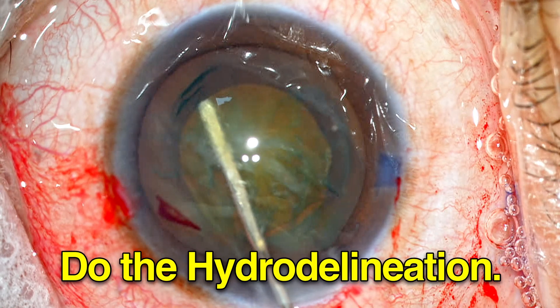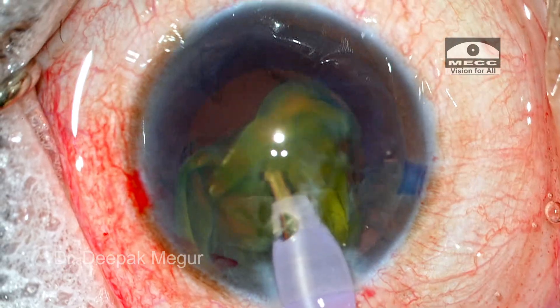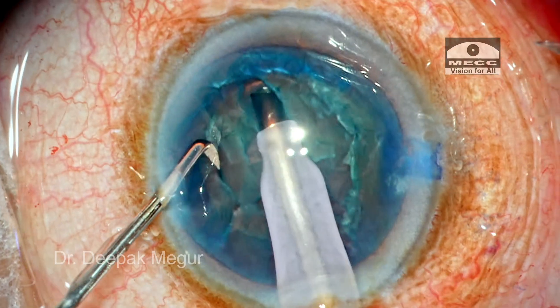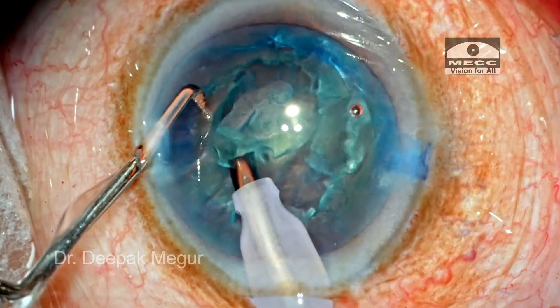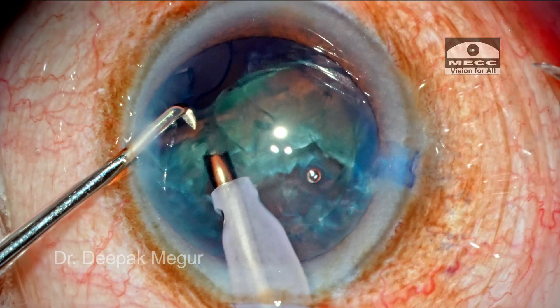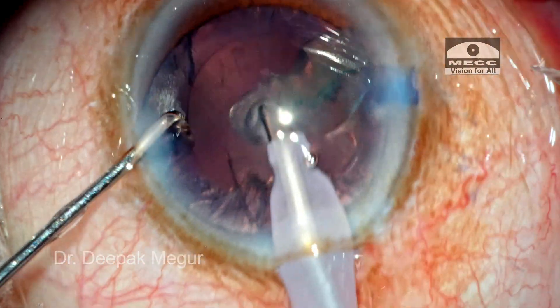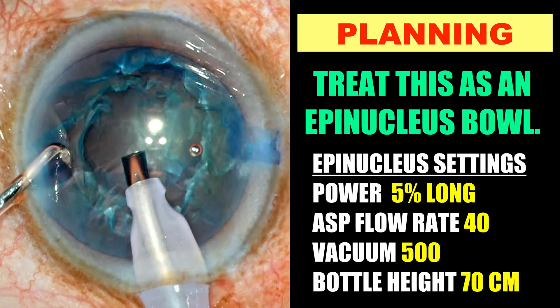If I had a second chance, I would have done hydro delineation, reduced the overall size of the nuclear mass, and used the carousel technique to flip the entire nucleus out of the bag into the anterior chamber and then emulsified. In this case, my initial judgment was not accurate. When I decided to sculpt and divide, I realized the nucleus was cheese-wiring and there was no hold to remove it — it was coming in pieces. In such situations, with bowl formation, the strategy is: first, trim off the epinucleus in some quadrants to reduce its diameter, then hold one of the anterior leaflets of the epinucleus, flip it out of the bag, and emulsify. The next time your nucleus assessment pre-op wasn't accurate and you have an intraoperative surprise, don't panic. Follow this strategy and you should be fine.